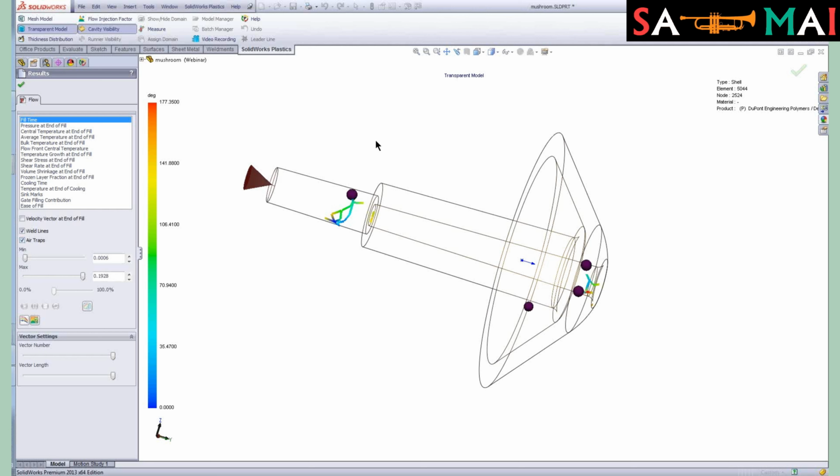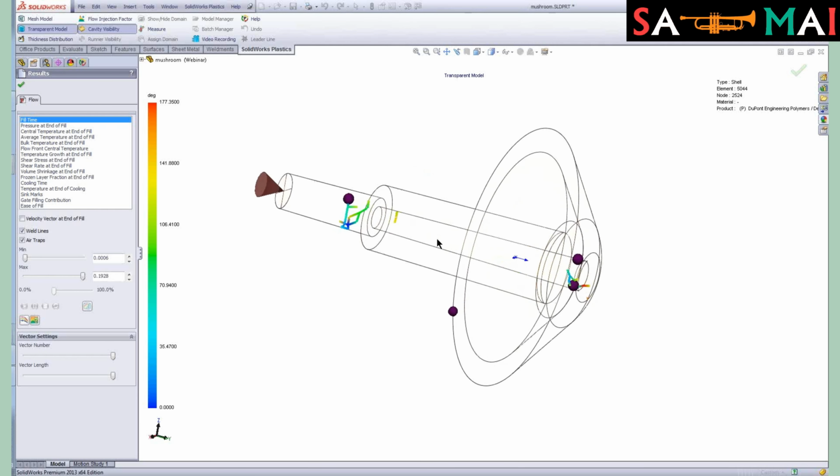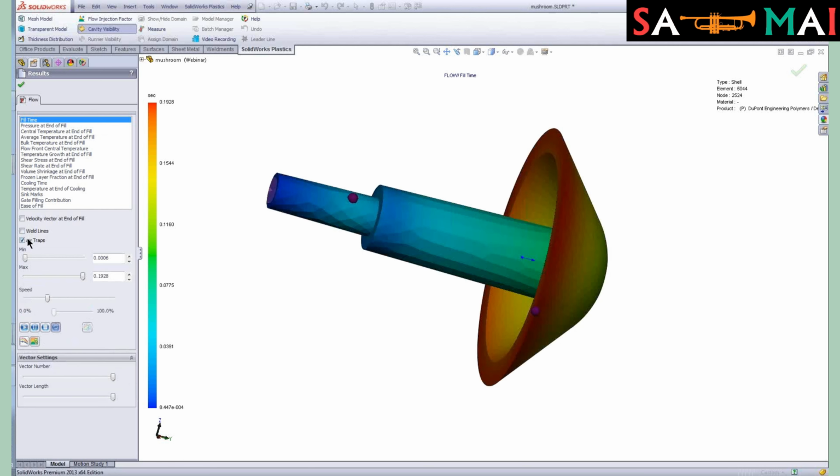Another thing that I'm going to turn on is the air traps. You can see I've got 4 different purple spheres that show up on this part. Those are indicating where the air would need to be vented from our mold. Air traps can be a very bad thing in injection molding. You can think about injecting very hot plastic at a high pressure. If you cannot vent these locations in the part, you can get something that's called dieseling in the injection mold industry, where basically you get a burn mark on the surface of the part. You actually get combustion out of the hot compressed air. So let's go ahead and turn those off.